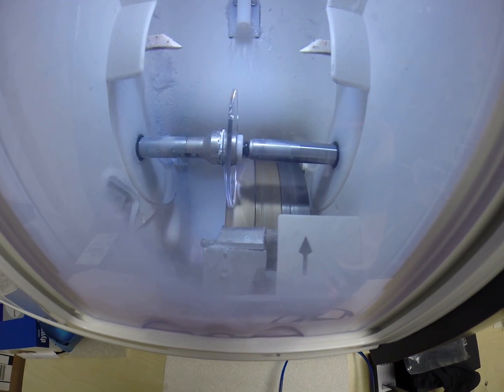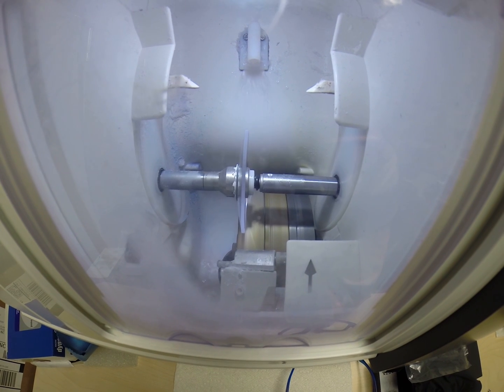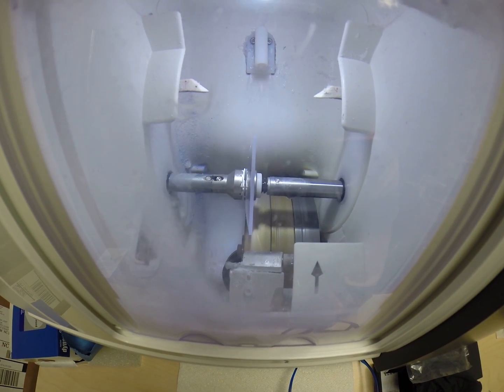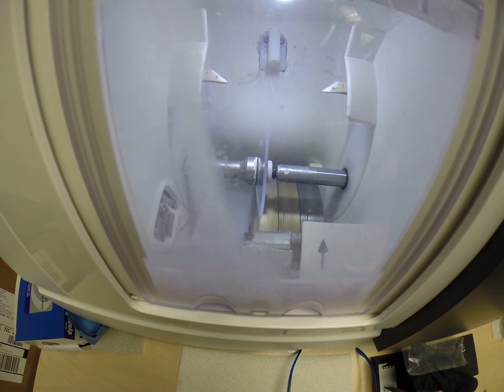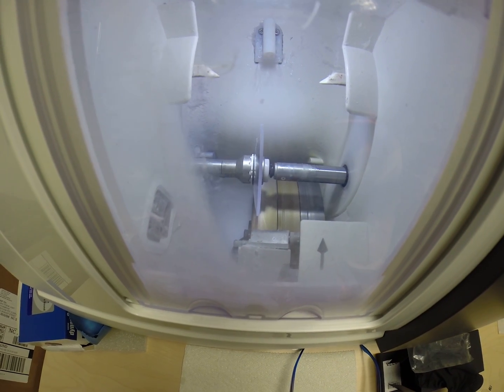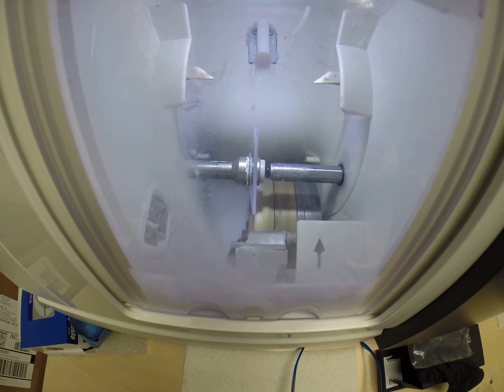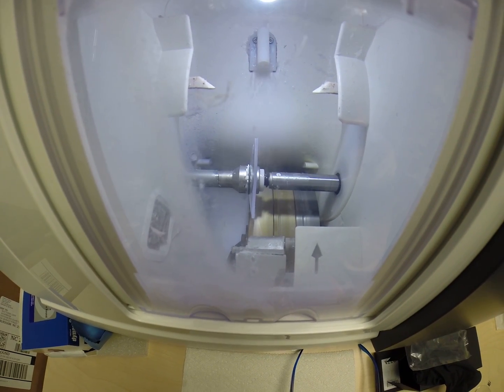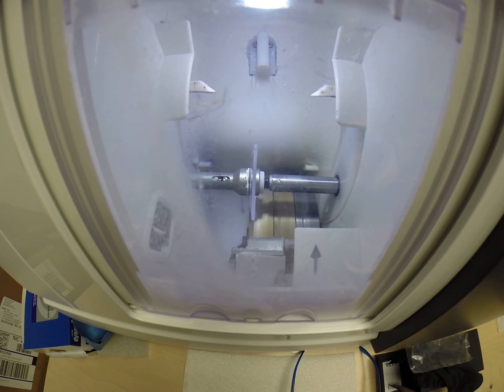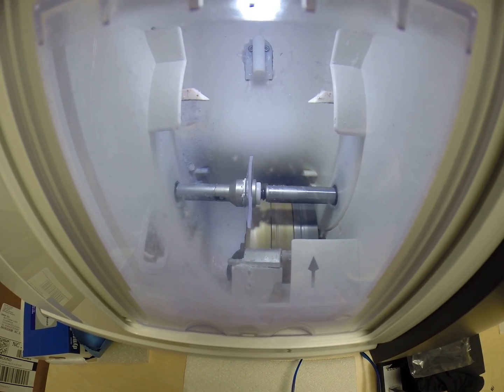So if you see light flickering in the background, that is water there to catch the optical sawdust. Polycarbonate lenses cut dry, where plastic, high-index plastic, and Trivex lenses cut wet, meaning the water sprays onto the lens during the cutting cycle. Now, it will not do that for these polycarbonate lenses, but it will spray onto the lens for the last 20 seconds of the cutting cycle, just to wash away any optical debris you may see beginning to form on the edge of the lenses.